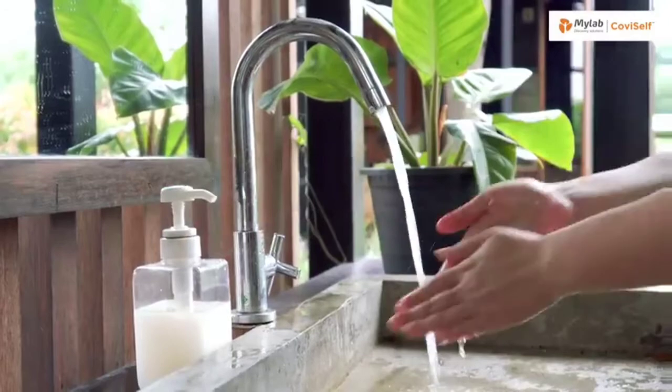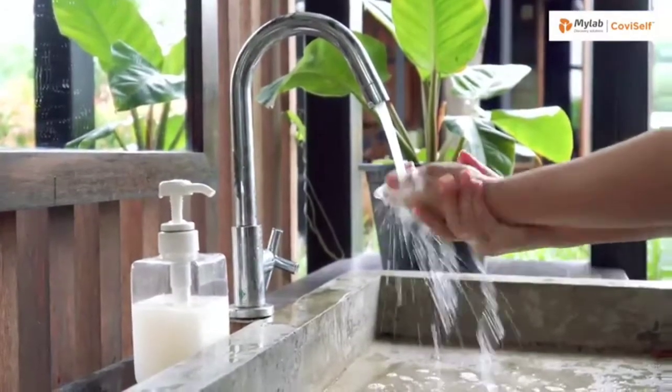First, it's important that you find a clean place to do the test. Identify a table and sanitize the surface thoroughly. Wash your hands with soap and make sure your hands are dry before you perform the test.